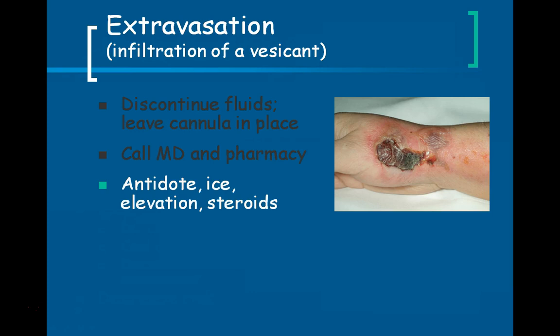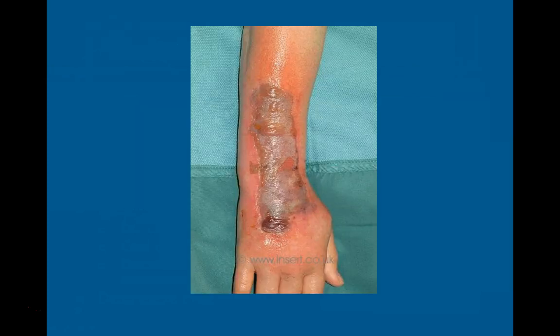And the reason why is there's a much greater potential for nerve damage and causing a loss in functioning of the hand. So this would be a situation where instead of starting the IV more distally, we would want to start it more proximal to the heart, where the vessels are larger and there's more hemodilution. Here's another picture of an extravasation, and you can see where whatever the solution was, it infiltrated and went right up the vein and is causing tremendous damage.